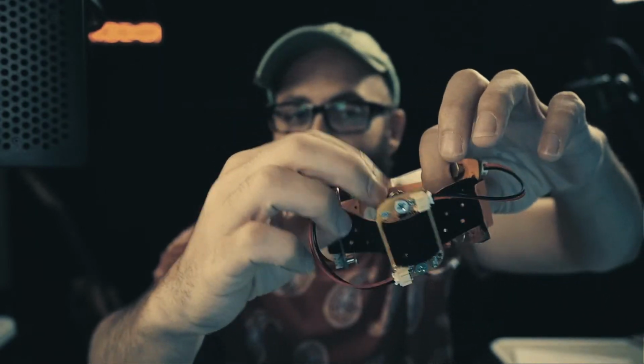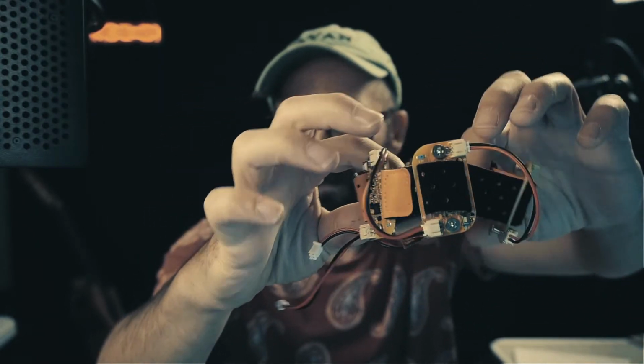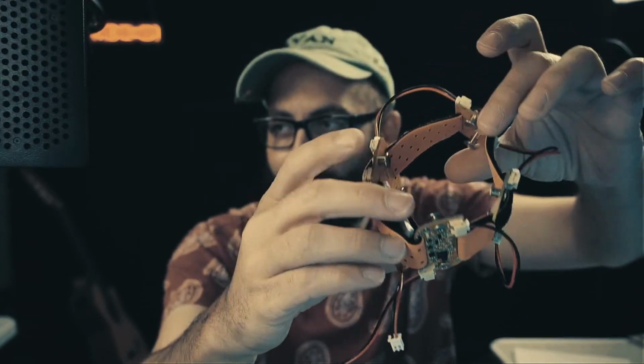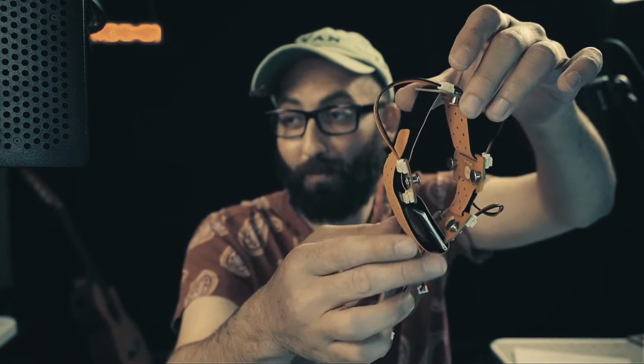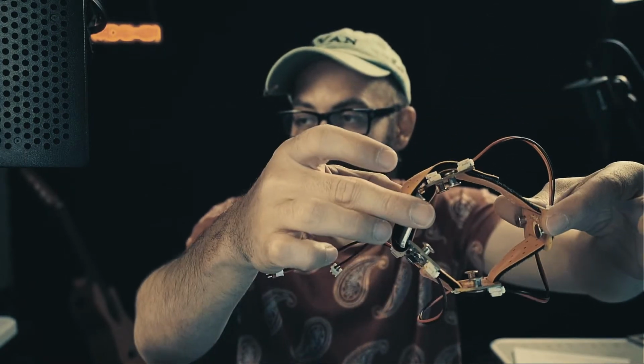Even the battery is super slim. This is separate, of course, but it has everything you need. And I could add 4 more quite easily. I probably will be buying 4 more, but I want to see how few we can use to discern 4-finger movements. And in the future, I'll be updating the LASK system to include the thumb and more different finger movements. But for now, it's a good way to test machine learning for sensor data.